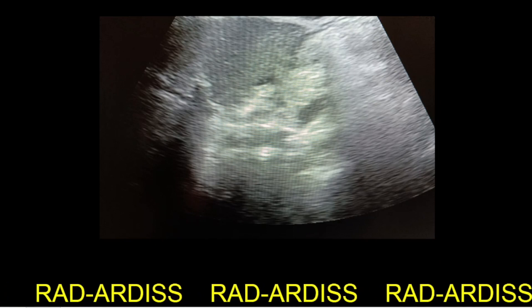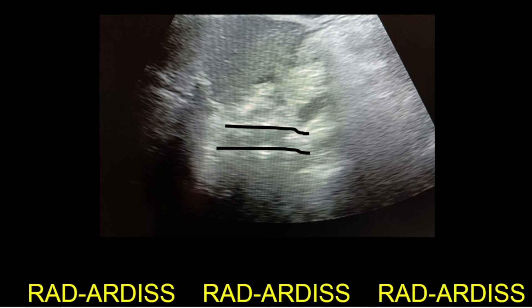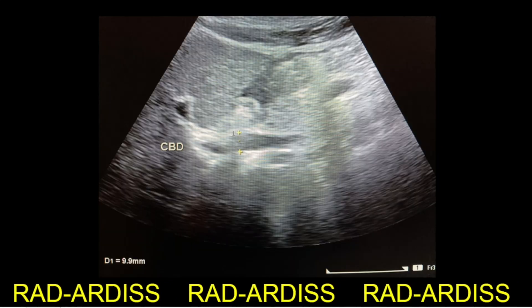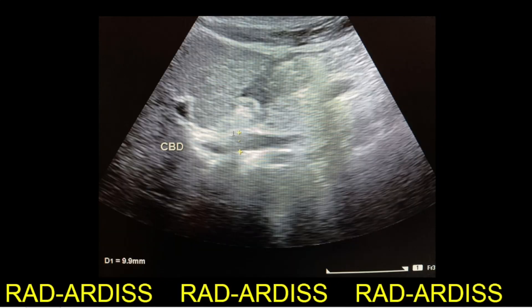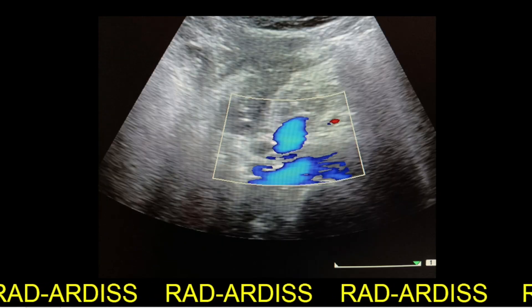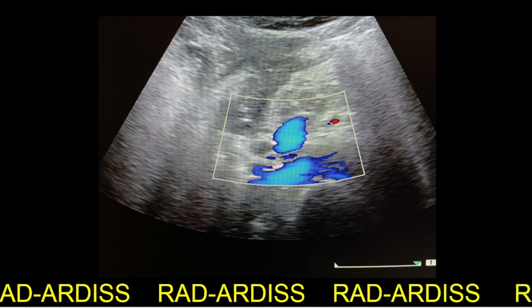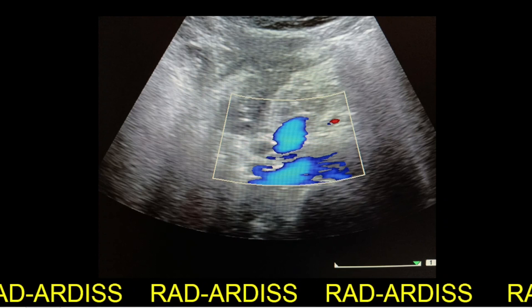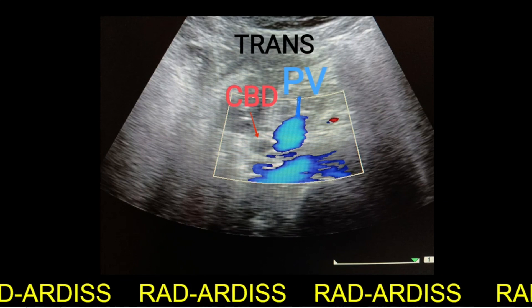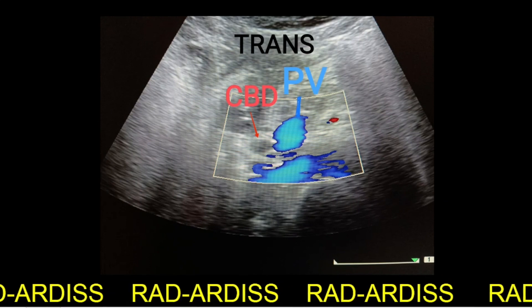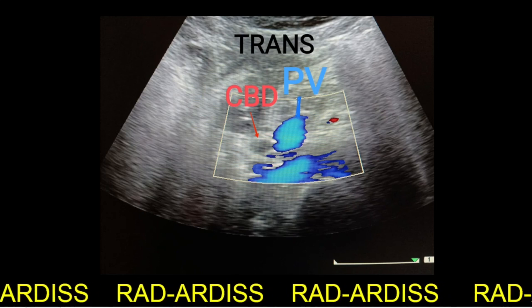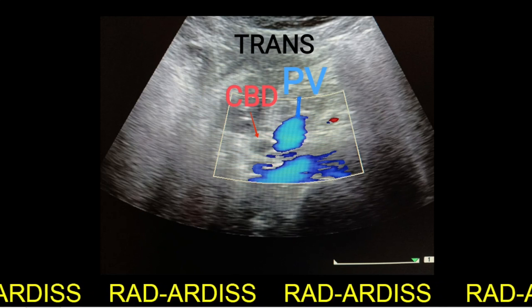The common bile duct is also dilated, measuring about 9.9 mm in diameter. This is the transverse section of the common bile duct at the level of the pancreas. In the annotated image, the common bile duct can be seen lateral to the portal vein.